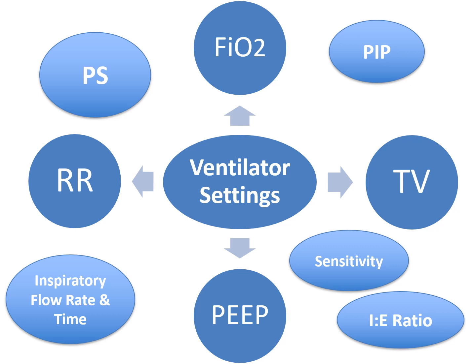Normally you breathe in, we'll say, 1 to 2: you inhale for a second and you exhale for 2 seconds. So usually it takes less time to inhale than it does to exhale. But we can also change that time for inhalation and exhalation so that it allows more time to deliver that volume, so that you can more adequately meet that tidal volume goal. It can be adjusted accordingly.